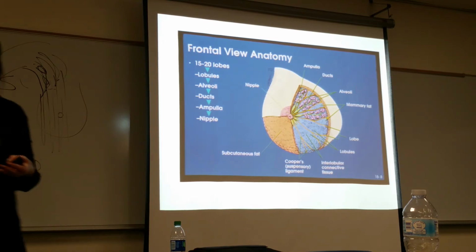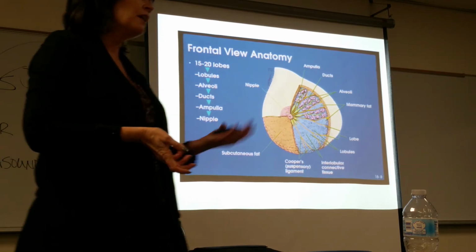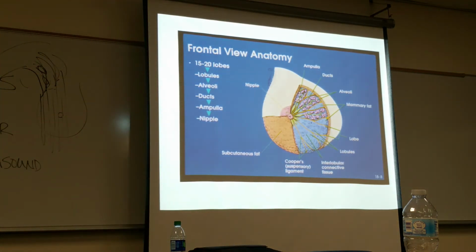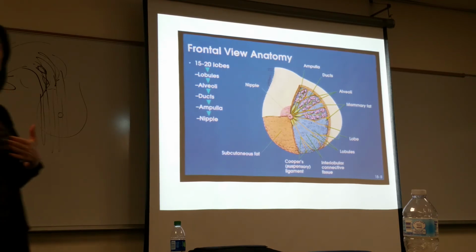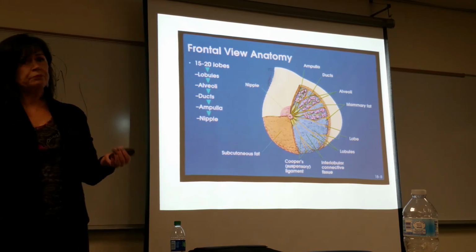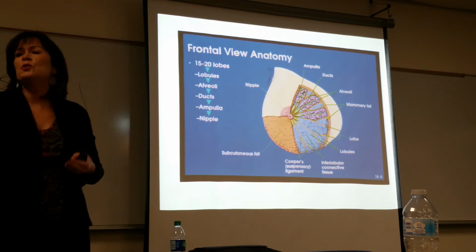And then, of course, when you work with a radiologist, they get to know you, and you just go, I see a cyst at 1 o'clock, and here I took pictures of it, and then they have to call it. That's the difference between ultrasound and radiography. I take the image and give the radiologist great images, and then they make the diagnosis from those images. With ultrasound, the radiologist only looks at what you give them.